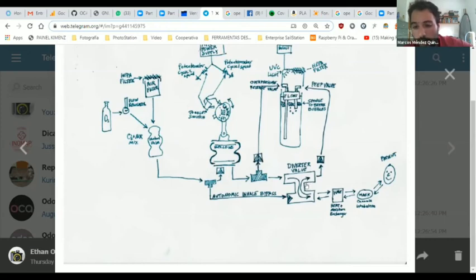When the patient is exhaling in a normal process, this valve closes, so the dirty, infected air from the patient's lung doesn't go to the clean part of the system, and it's diverted to a check valve and the PEEP valve system that's also regulated in a tube. This tube is floating on a buoy, and you regulate the height of the tube. We mark the scale on the tube with a pen and a ruler, so we can set 10 centimeters, 5 centimeters, or 20 centimeters of PEEP pressure. This is all manually adjusted.